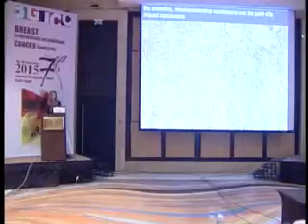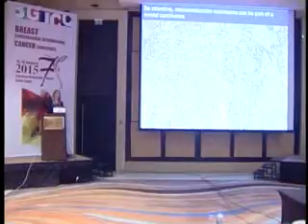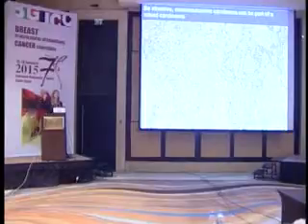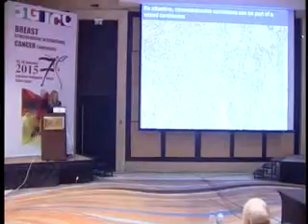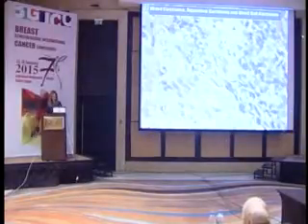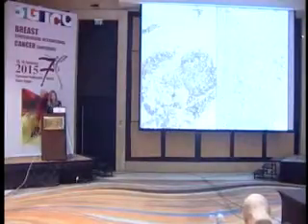So neuroendocrine can be part of a mixed carcinoma, squamous cell and neuroendocrine. You might see keratin curls. You might see endocervical adenocarcinoma. Next, do you remember my previous slide in the first lecture? Next to small cell, you could see it in squamous cell carcinoma. It's here. So the mixed, again, just be aware of that.